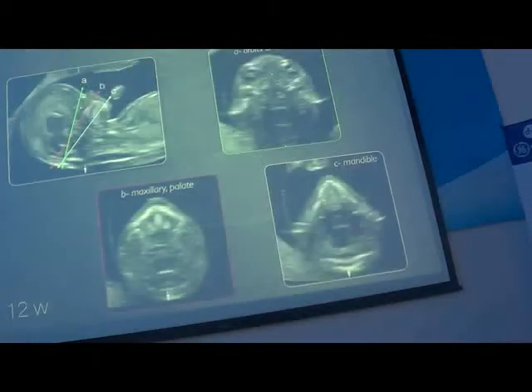Now we will start with the first trimester. What is possible to see? Bây giờ tôi sẽ trở lại với thời điểm 3 tháng đầu. Cái gì chúng ta có thể nhìn thấy ở đây? This is from a 3D block, 3D volume, the different sections. On this one, the green one, you can see the eyes and the ear. Với hình ảnh 3D ở đây thì lát cắt A màu xanh sẽ cho phép chúng ta nhìn thấy mắt và phần tai.